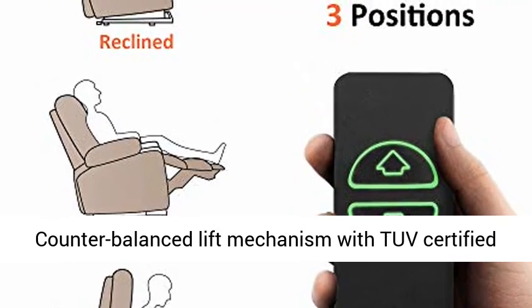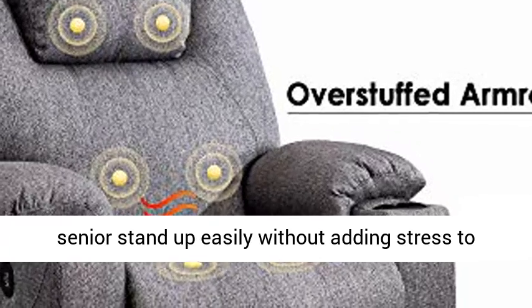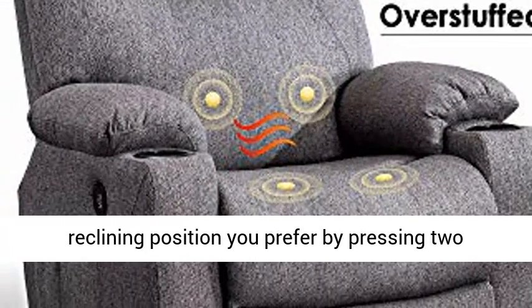A counter-balanced lift mechanism with a TUV-certified motor pushes the entire chair up to assist the senior to stand up easily without adding stress to the back or knees. Smoothly adjust to the lift or reclining position you prefer by pressing two buttons.